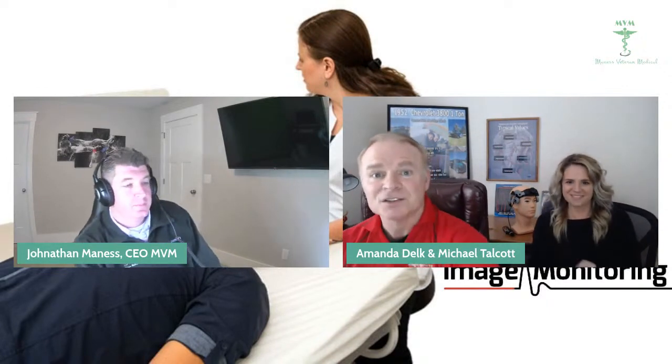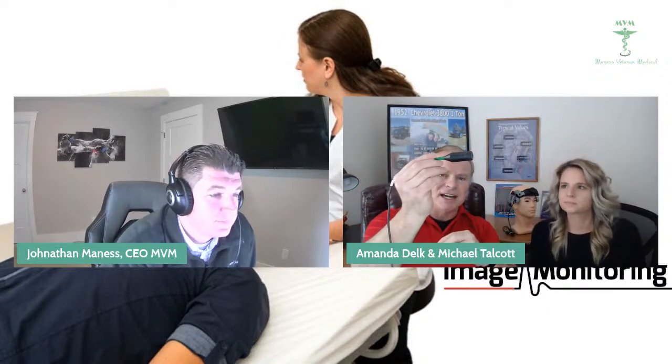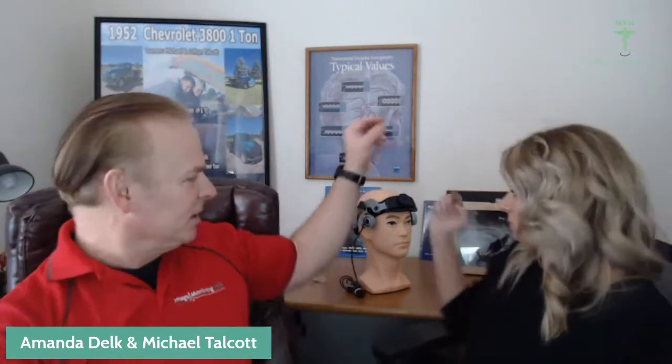Okay, great. So what you have right now is the Doppler. This is a diagnostic probe, and the diagnostic probe goes on the side of the cranium like so when we're doing freehand. If we're not doing freehand on the patient, then we use the headset that Amanda has. That headset allows you to put it on the patient, and that stays on the unit. And that's really all the supplies, except for, of course, gel, which you sell, and that's all you really need.